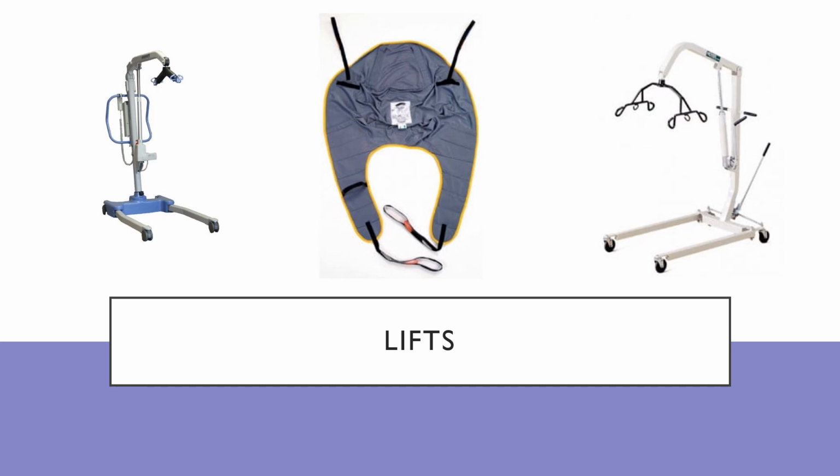Accompanying the lift is the sling. Slings come in various forms and can be disposable or reusable. Some are considered to be sitting slings as they get the patient to be in more of a sitting position, while others allow for the patient to be supine in the transfer and encompass the patient's whole body. Sitting slings can come in a mesh material or with a cutout on the bottom that allow for transfers to shower chairs and toilets for improved participation in hygiene and grooming tasks.